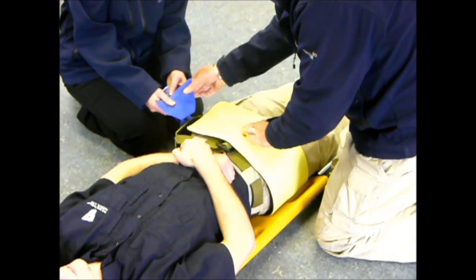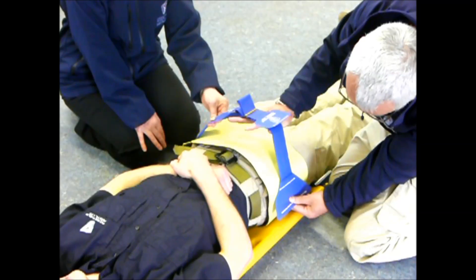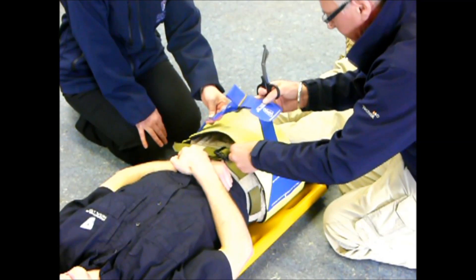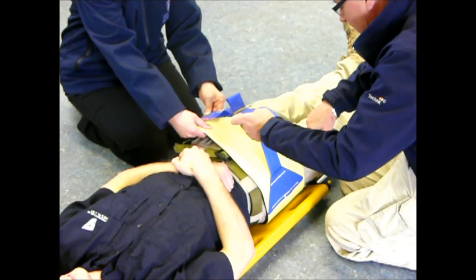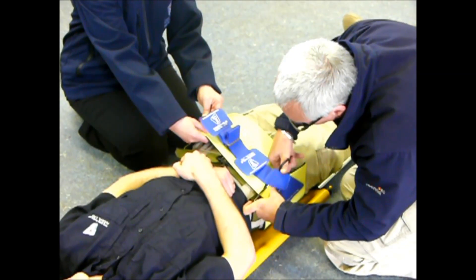I can now take the second anchor, keeping the strap well away from the yellow belt. I can now cut to size, again making sure I'm not cutting through the blue strap.